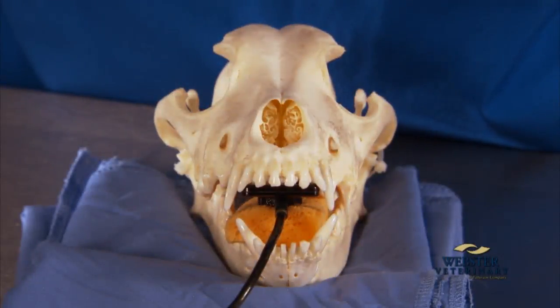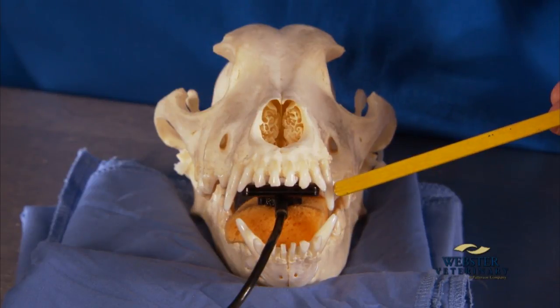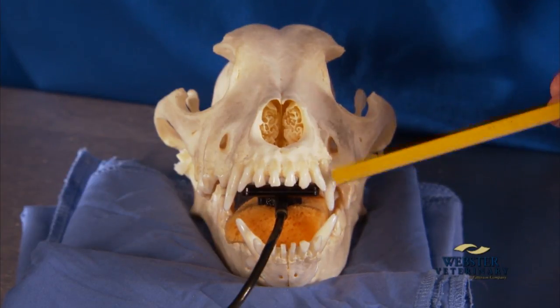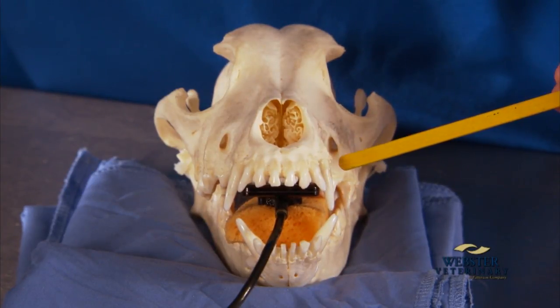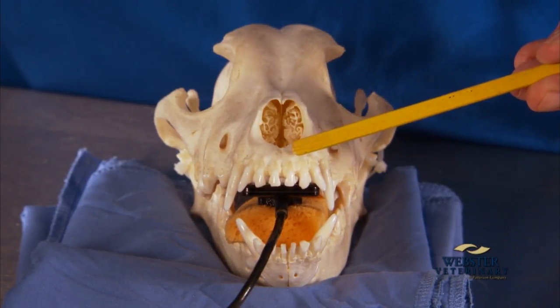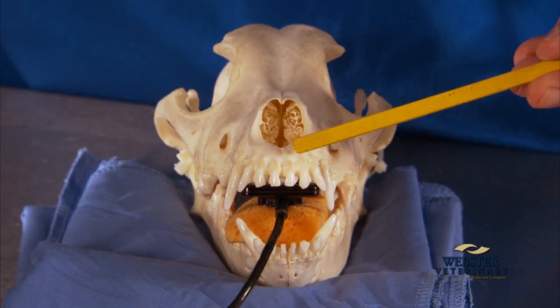In order to obtain images of the maxillary canine teeth, it is important to learn the oblique imaging view. Oblique imaging is necessary because the maxillary canine teeth are superimposed over the first, second, and third premolar in the rostral maxillary view we took earlier with the incisor teeth.